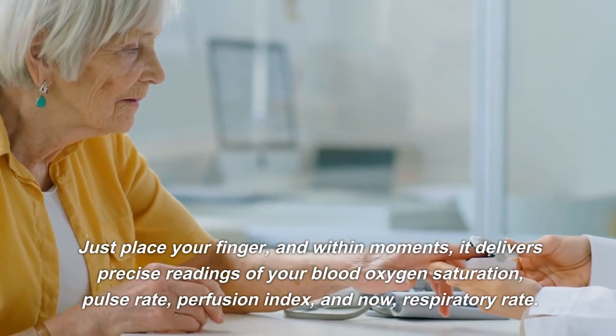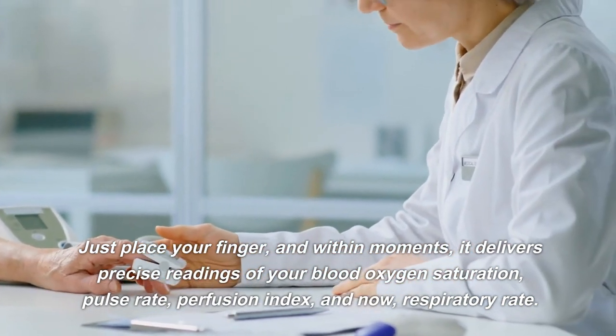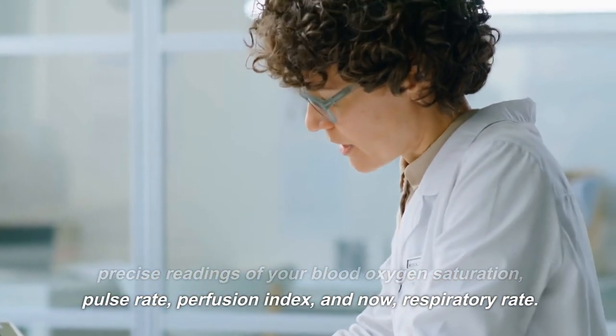Just place your finger, and within moments, it delivers precise readings of your blood oxygen saturation, pulse rate, perfusion index, and now, respiratory rate.